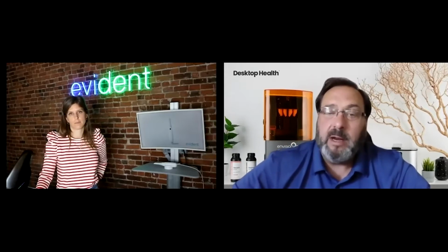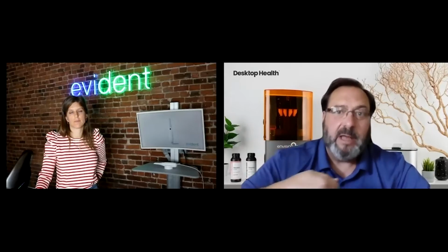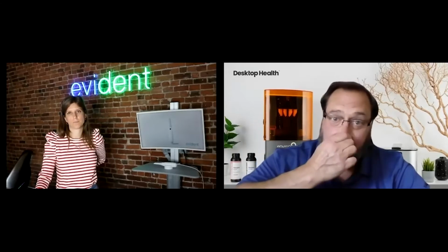Some people will do an immediate scan and have the design center design a denture, and then use that denture as a custom tray and do a wash impression, make sure it works as a try-in at the same time, and then send it back for a final. So there are different techniques for getting to that stage, and it's being worked out. There are so many options, and that's why it's important to have a good relationship with your design center, or to know what you're doing in exocad or 3Shape, because that's what's replacing all those visits: the design component.